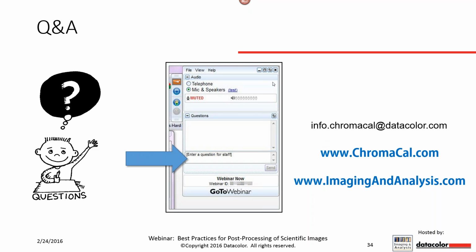Also wanted to just add to that we do have customers who use our calibration slide for quality assurance, performance measurement, and monitoring of their whole slide scanners over time. So it's a way for them to see how they change, maybe light source and so forth, over time, and they can then advise the engineers to come in and do an adjustment if needed. Yeah, we didn't show you that capability of the ChromaCal software today, but if anyone's interested in that, certainly feel free to contact us, and we can take you through that capability specifically.